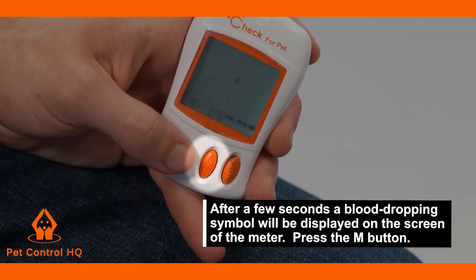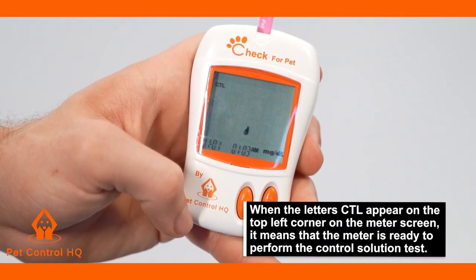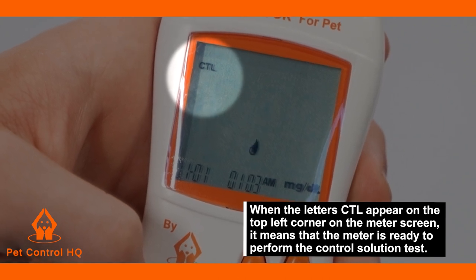Press the M button. When the letters CTL appear on the top left corner of the meter screen, it means that the meter is ready to perform the control solution test.